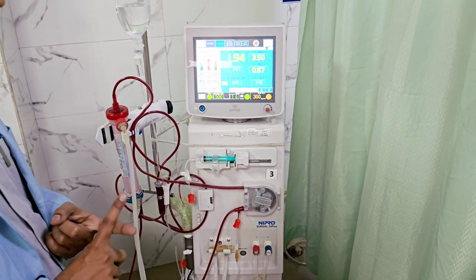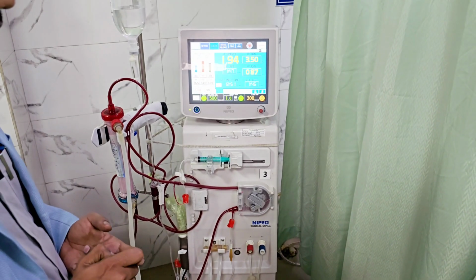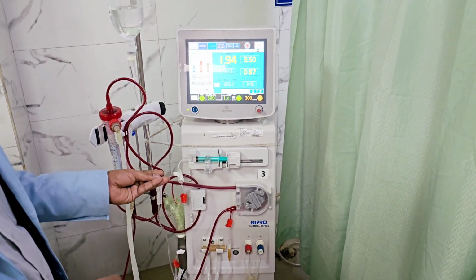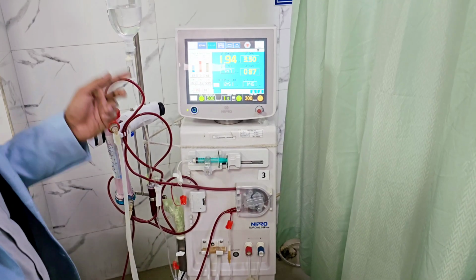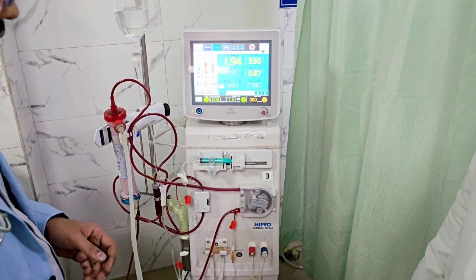The first thing that we do is flush the circuit every 30 minutes with normal saline. So now you can see how the blood is going to get diluted as we flush it. How much amount do we use? Ideally 100 to 200 ml.